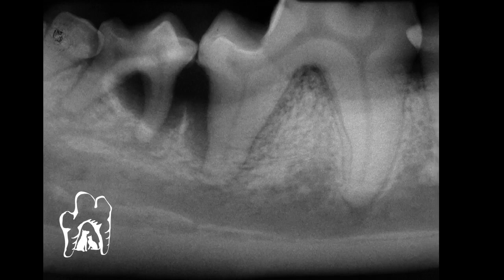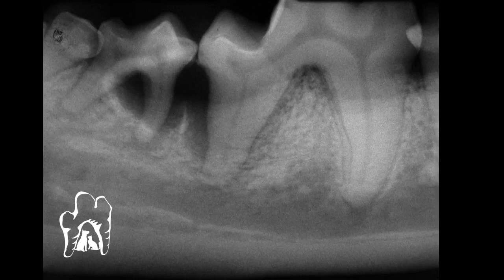If we leave it, it's very likely going to occur again, so we want to get that out of there, even if it's a minor defect. This one's got some major things going on. You see the increased periodontal ligament space around that distal root, and there's probably a periapical lesion on the mesial root, so we'd want to get rid of that.